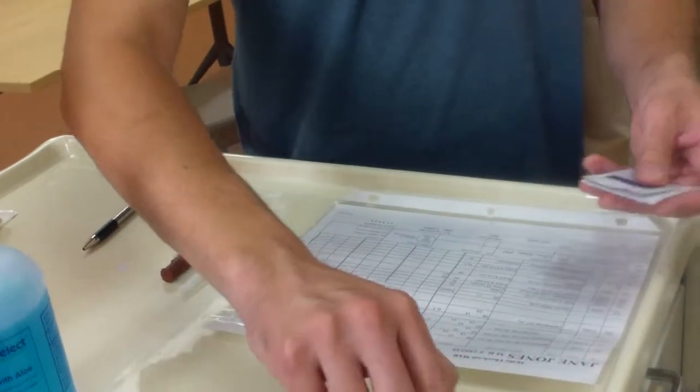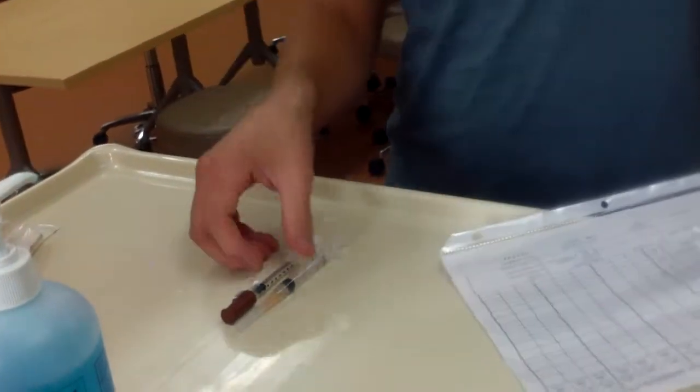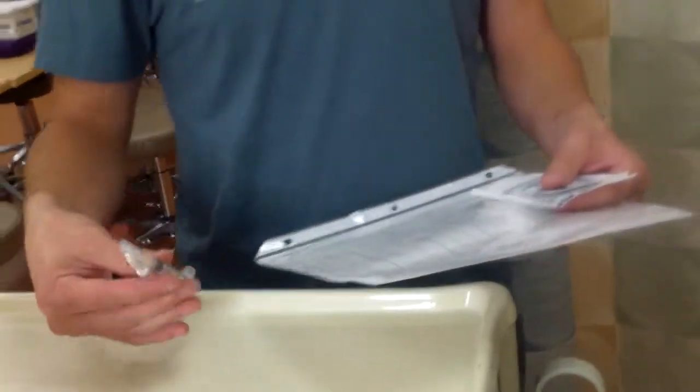So I have the MAR. I'm going to need a few alcohol pads, alcohol swabs. I need a couple gauzes. So I'm going to take my medication, not leaving it out of my sight at all, in my MAR. I'm going to go to my patient's room. I have my medication. Go to my patient's room, knock.